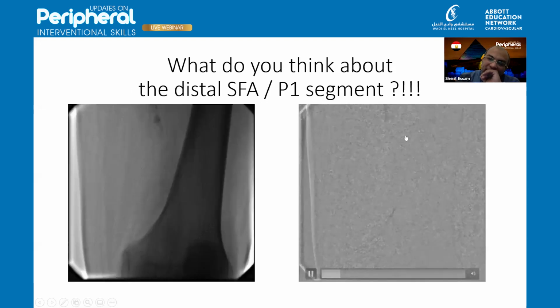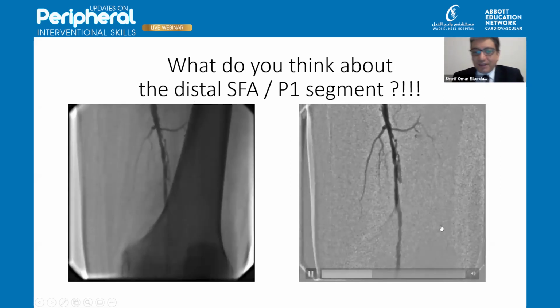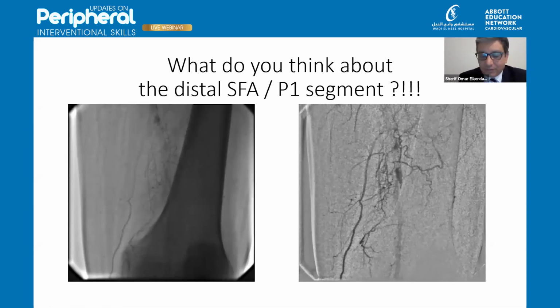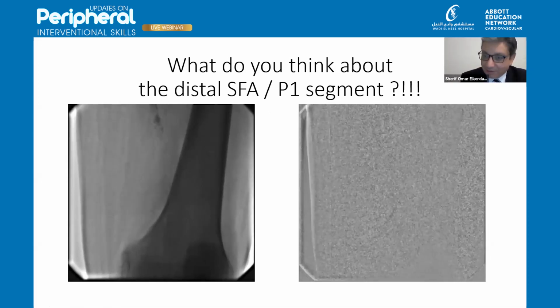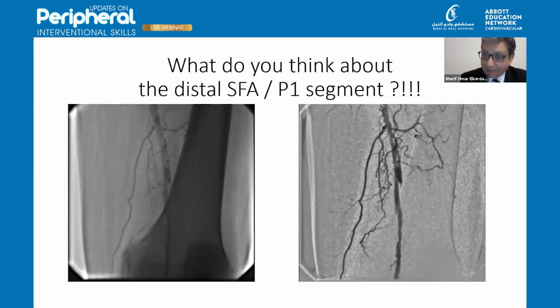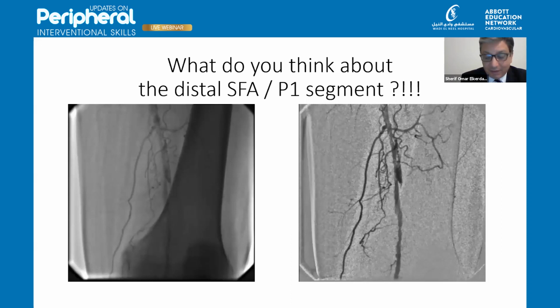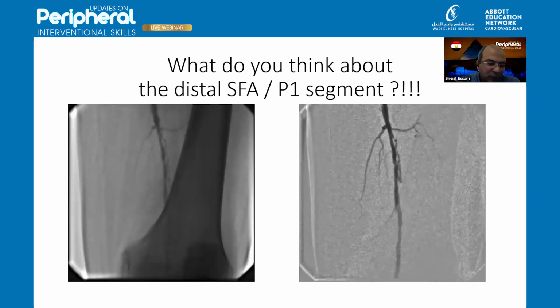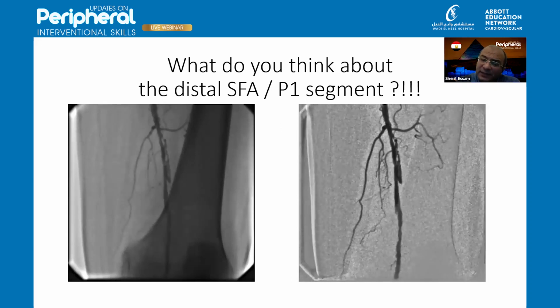Okay, and again, Sharif, to answer your question, in such kind of lesions you have to wait for some time, maybe 5 to 10 minutes, and re-angiogram again. If you find a recoil immediately, the same. Yes, that's what we usually do, and it was the same. This image is exactly the same after 10 minutes.